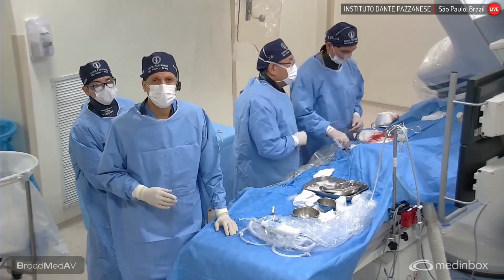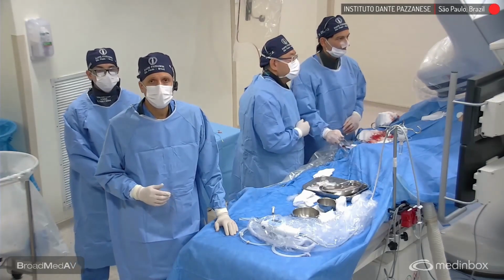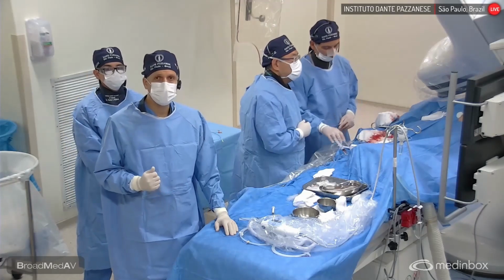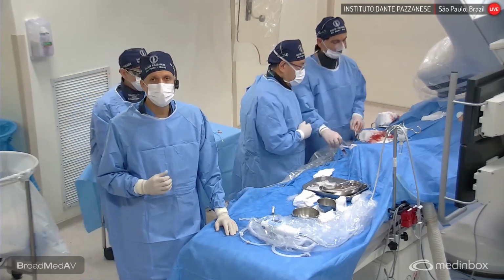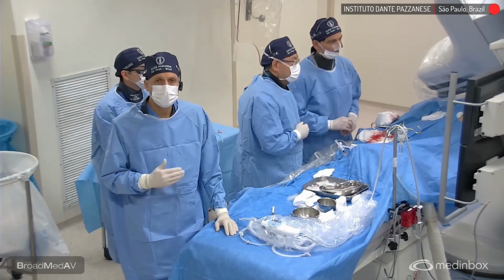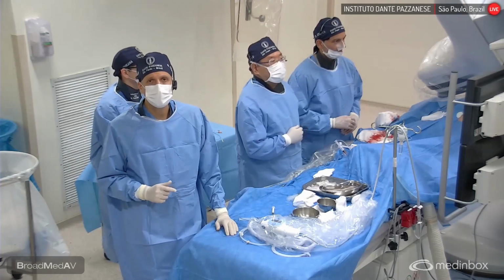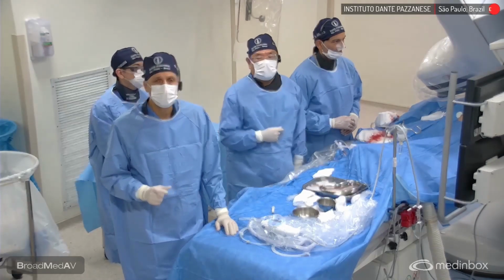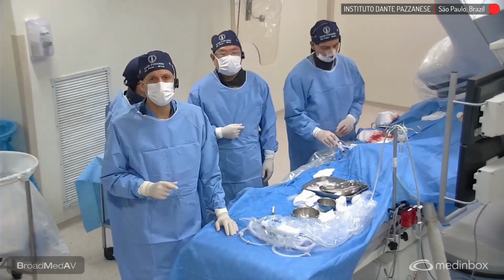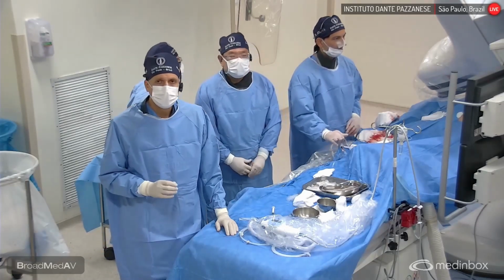He was eligible for either revascularization method, and we are demonstrating here with IVUS and angio-based imaging guidance. This procedure included first a stent in the mid LAD, then we stented the left main circumflex with a nano-crush technique.